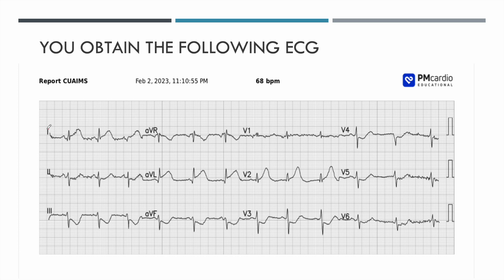If you look at lead 1, you notice there is a little bit of elevation — some ST elevation in lead 1. In lead 2, we see some ST depression. In lead 3, there's fairly substantial ST depression, and some depression in AVF as well. So you have ST depression in the inferior leads. That may be due to ischemic changes in the inferior leads, or it may be due to reciprocal changes from elevation in other areas of the heart. We have elevation in lead 1 and depression in the inferior leads. AVR is not super relevant to this particular case.